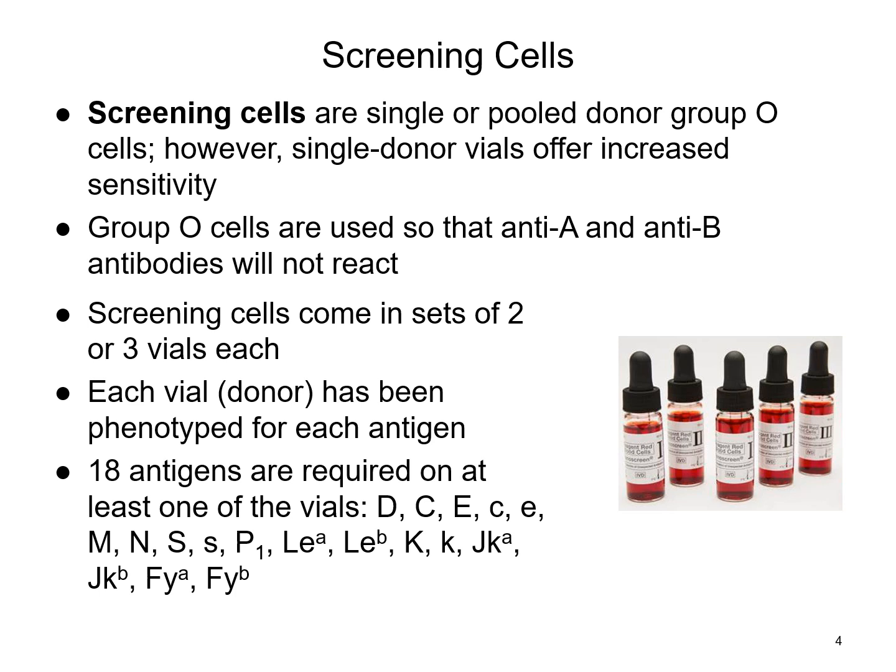if a patient is, let's just say, an O, that means they produce anti-A and anti-B. If we were to use a donor cell that was an A donor, then you know that O patient's anti-A is automatically going to attach to those A antigens on those reagent cells. Therefore the cells themselves have to be group O so that they lack those A and B antigens, so that the patient's blood type antibodies don't react with those cells.